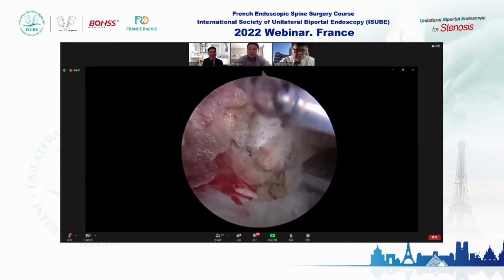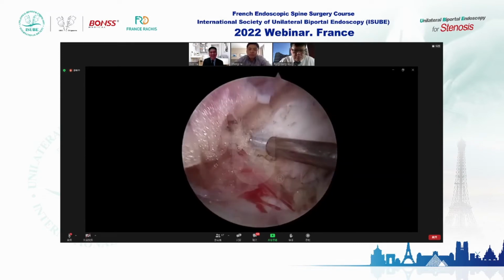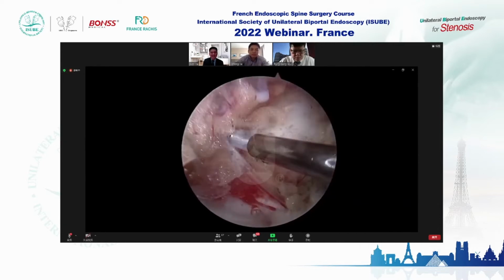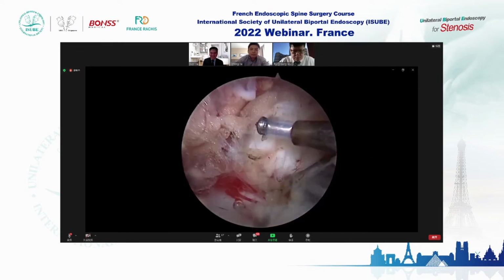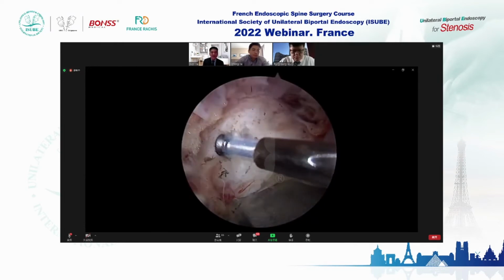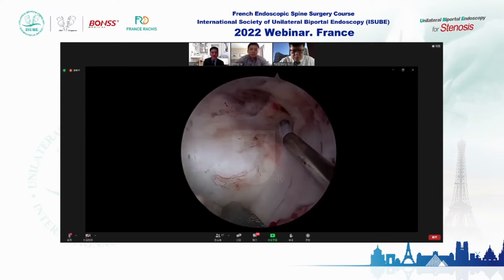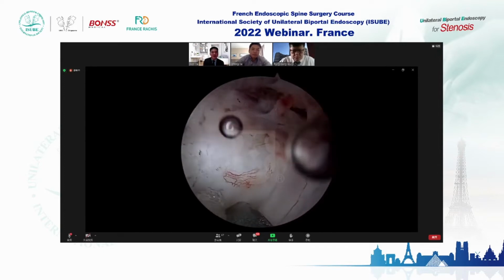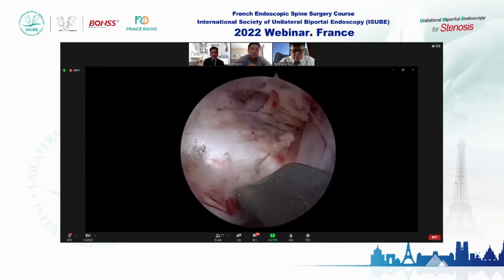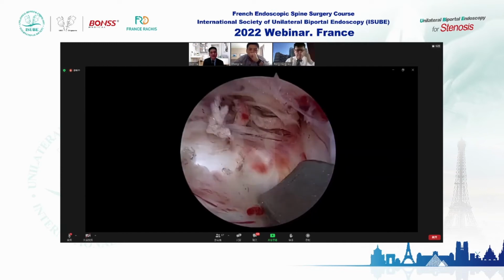Because I insert the endoscope too deep, so you will not see which is the third portal, which is the ipsilateral portal. Yes. 就刚才跟张伟教授讲，他哪个切口放器械跟我们讲，尤其从第三切口，我们要认真学习一下，因为这是张教授对我们双通道内镜的一个非常大的贡献。提出这个transportal，在国际上也得到认可，也是我们中国人的骄傲。Yeah, this is the lower part of the disc fragment.